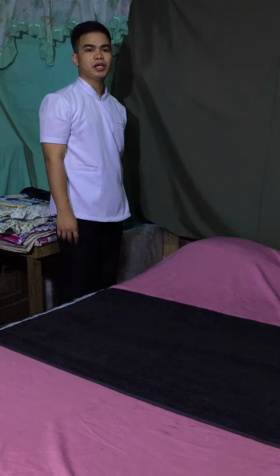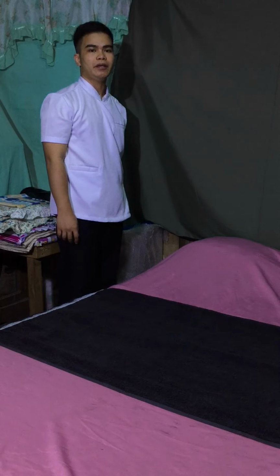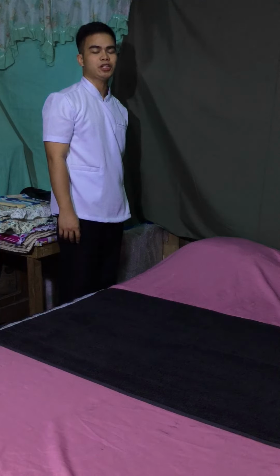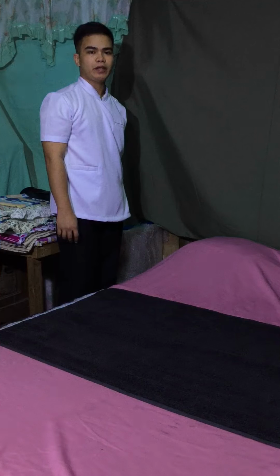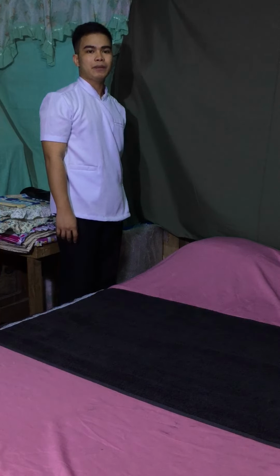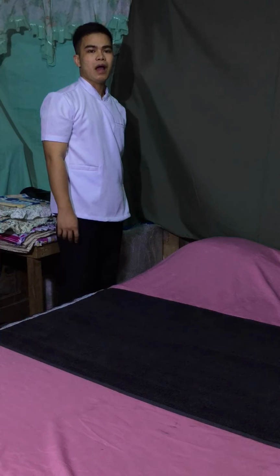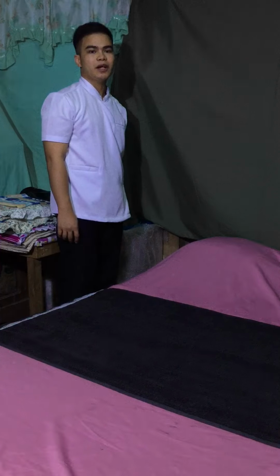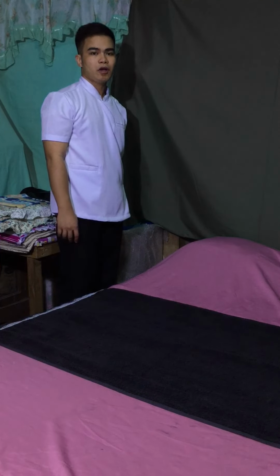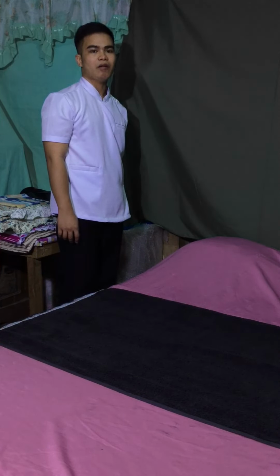Lay the cloth draw sheet over the waterproof sheet in the same manner. A draw sheet can aid in moving the patient in bed. Optionally, before moving to the other side of the bed, place the top linens on the bed, hem side up. Unfold them, tuck them in, and miter the bottom corners. Completing one entire side of the bed at the same time saves time and energy.